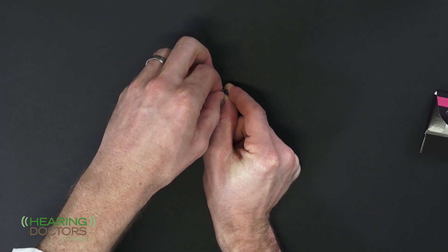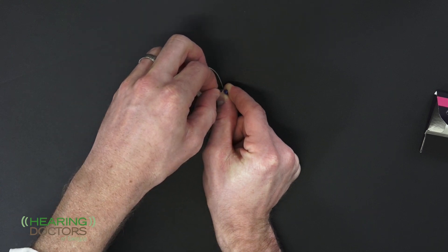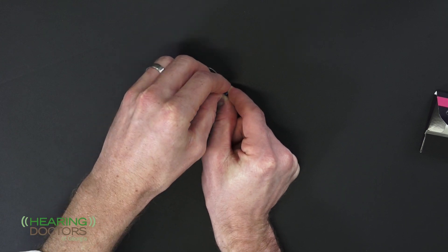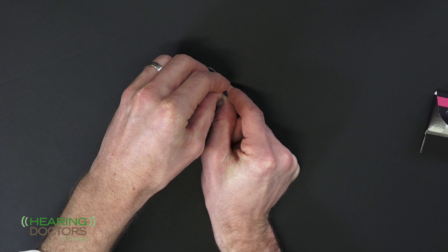You will then pull up, you will turn it over, and you will place the new filter in the receiver.